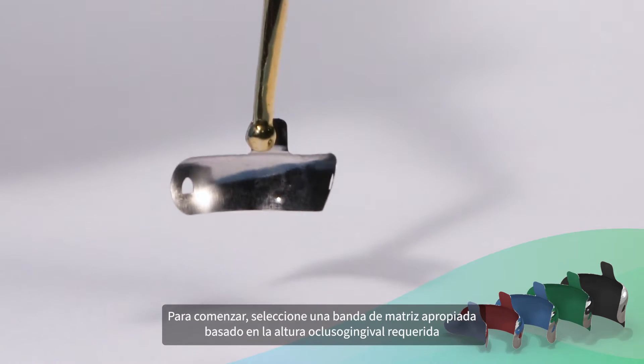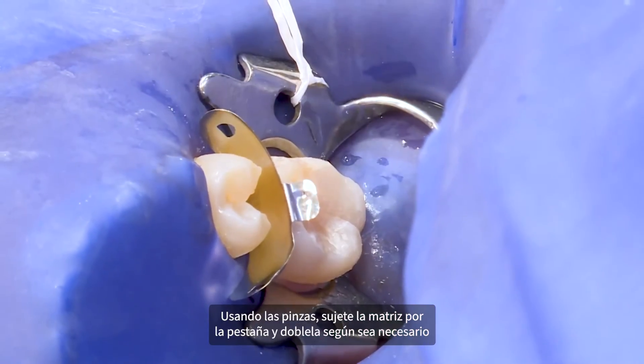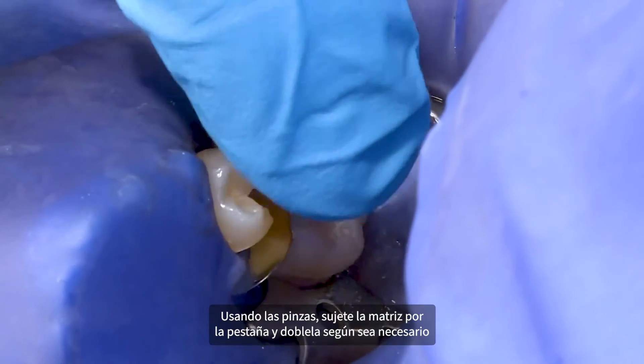To begin, select an appropriate matrix band based on required occluso-gingival height. Using the pinned tweezers, grip the sectional matrix tab and bend as needed.